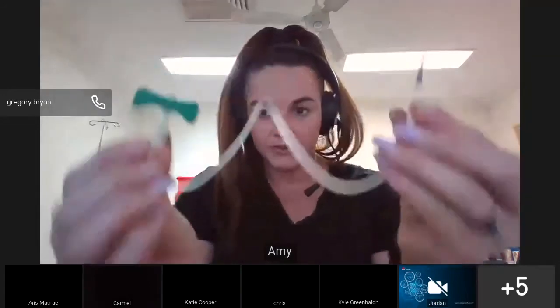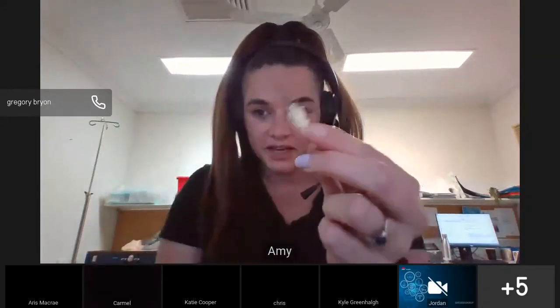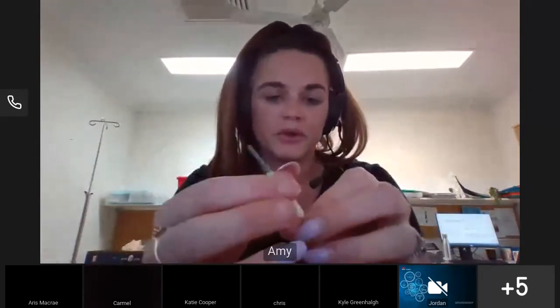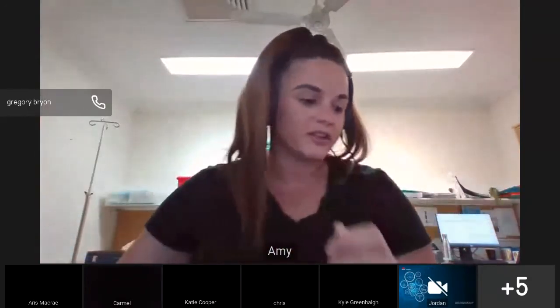So this is my butterfly that I work with here where I'm at. I would be taking that lure adapter off, and please be careful when you do that. Underneath that rubber is a bit of a spike, so it is clean, but still nobody likes to get stabbed. Take that off, dispose of it in the sharps.